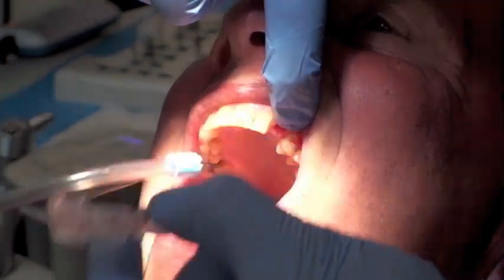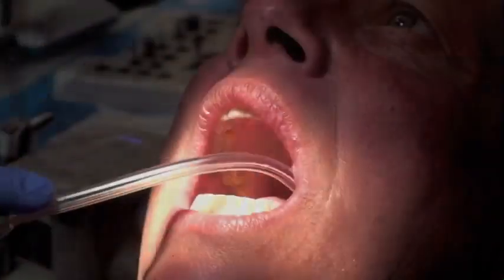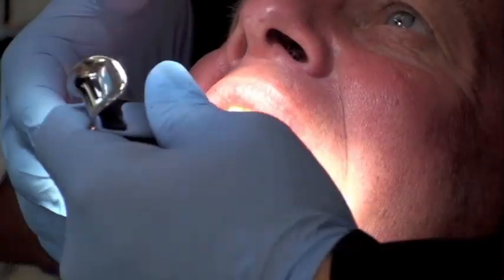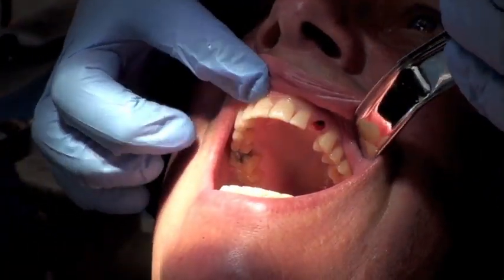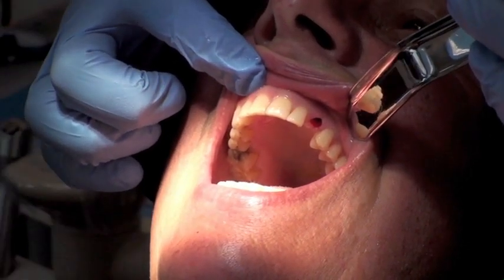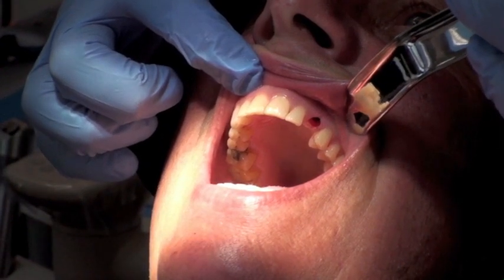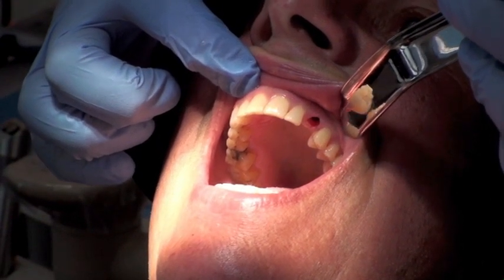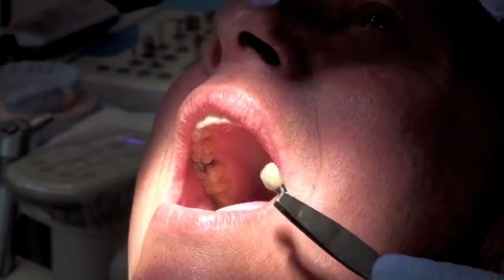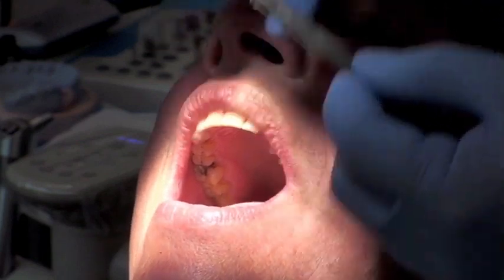The site can be irrigated and flushed. You can see that it's an aseptic technique and quite bloodless. Minimally invasive, if you ask me. You can see that the tissue punch, because of the profile of the gingiva, has created an ideal zenith. This zenith would essentially allow us to create the ideal or optimal aesthetics in terms of emergence profile.